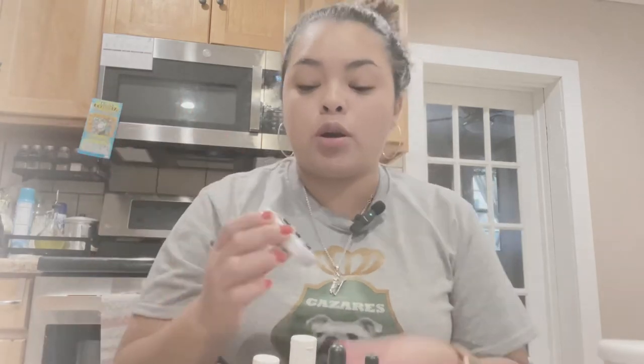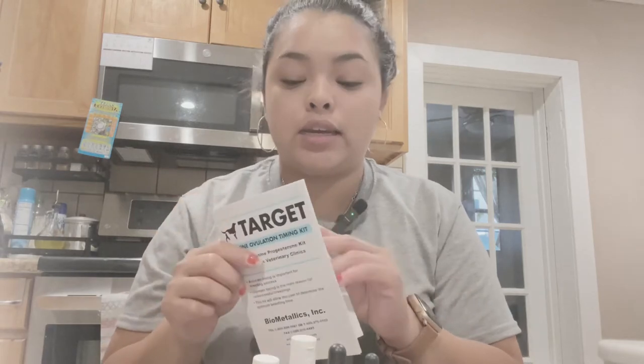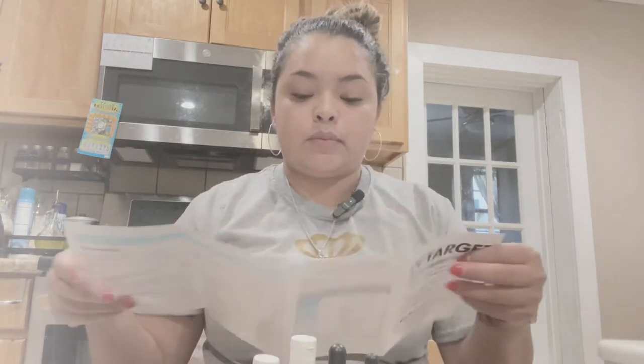The first thing you need to do is pull blood from your female — I'm going to show you a quick video on how we do it. It takes like two or three people; me and my husband can do it, but if the females are a little nervous they kind of don't want to wait. You're also going to need a timer — timing is very important. All the instructions are in the kit, so let's get started.